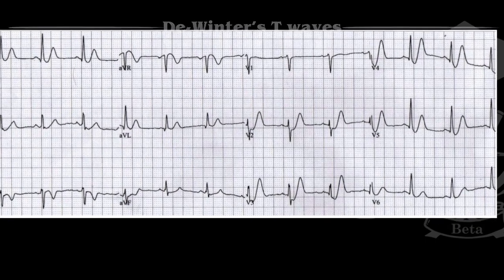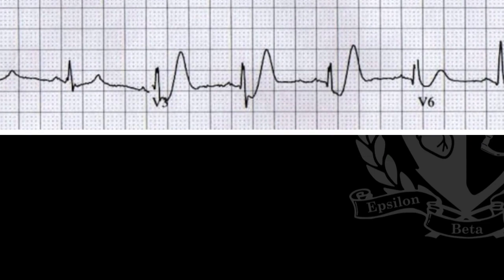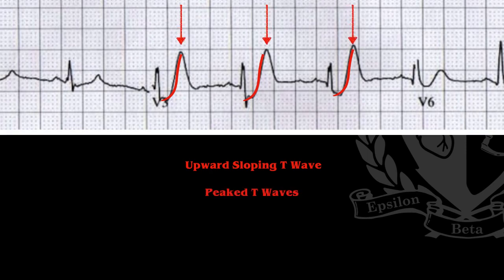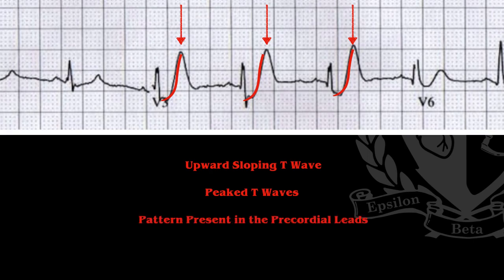If we zoom into V3, this pattern of T wave is known as the DeWinter's T wave. It's characterized usually by an upward sloping initial portion of the T wave with some peaking of the T waves. There's no hyperkalemia involved with these patients typically, but this peaking of the T wave is exclusive to the DeWinter's T wave, not hyperkalemia. The pattern is present in the precordial leads — most notably in V3 progressing into V4, V5, becoming more subtle as it makes its way out to the lateral precordial leads.